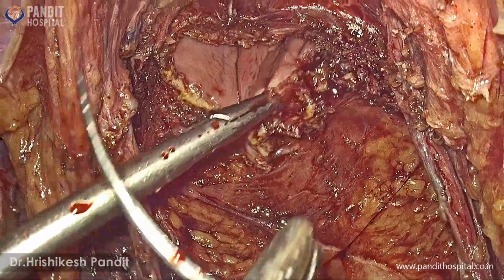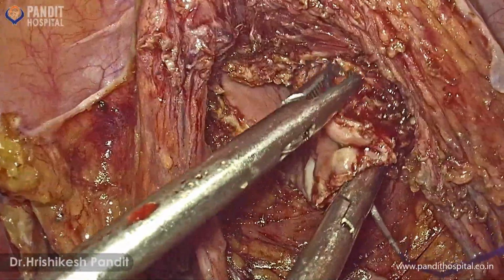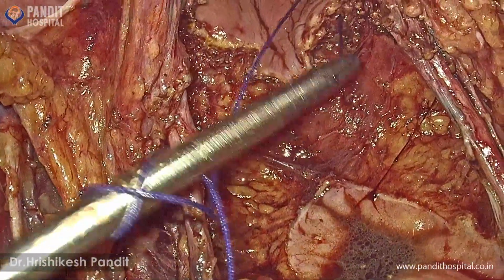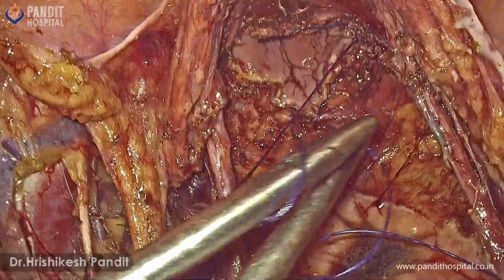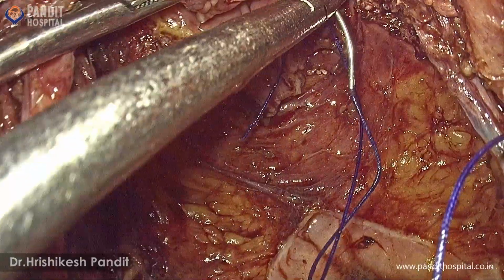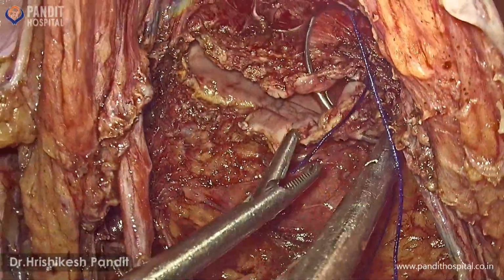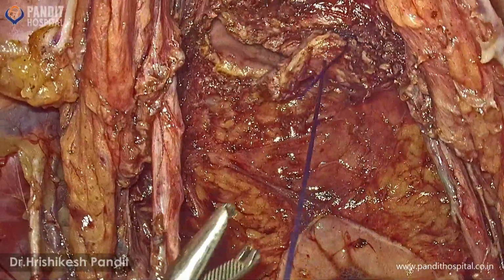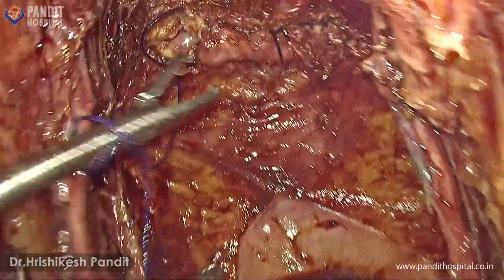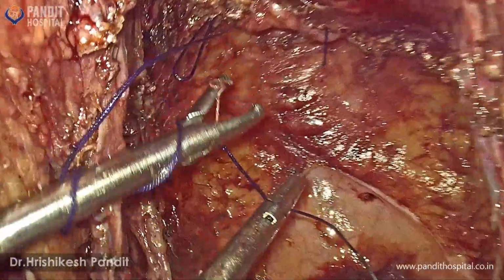Next step is closure of the vault, which is done using Vicryl number 1 round body. It is always done from anterior to posterior, that is from high risk to low risk area, so as to prevent the needle from puncturing into the bladder. Vault is closed in a continuous manner. After closure of the vault, hemostasis is ensured.